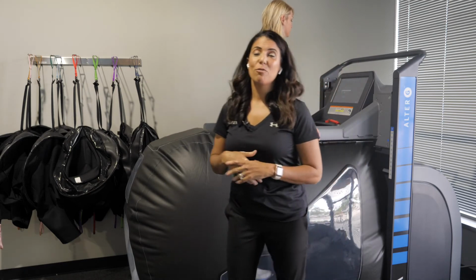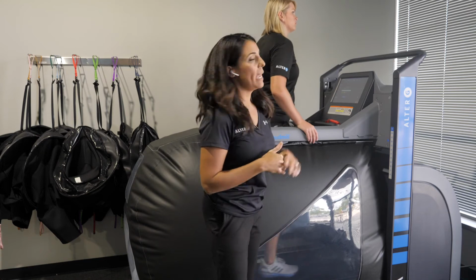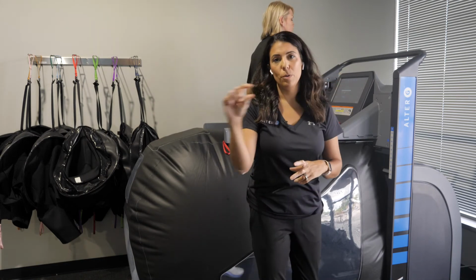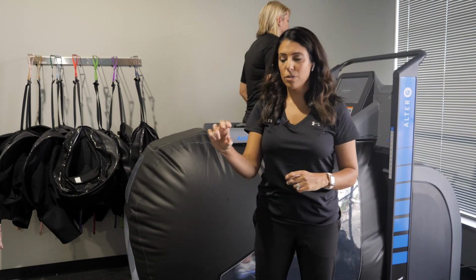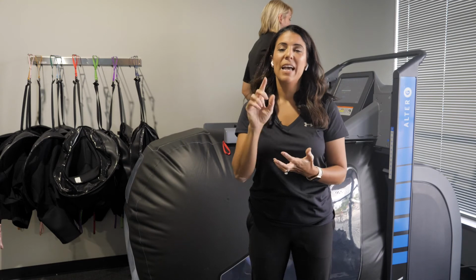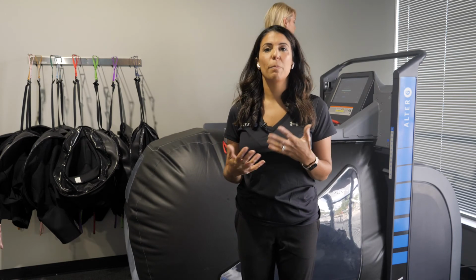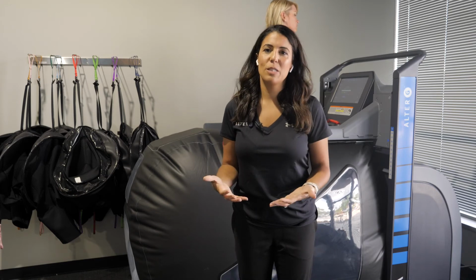The other feature that can really be beneficial for your clinic is the pain recording feature. If I press pain on the left side of the screen, there'll be a pop-up screen with a numeric scale as well as the emotions. So the facial pictures, the face icons, and the numbers will all pop up, and the patient can record their pain. This is a really nice way, again, to see at what level of body weight support your patient has the most pain, or they can tolerate with a normal amount or decreased amount of pain.